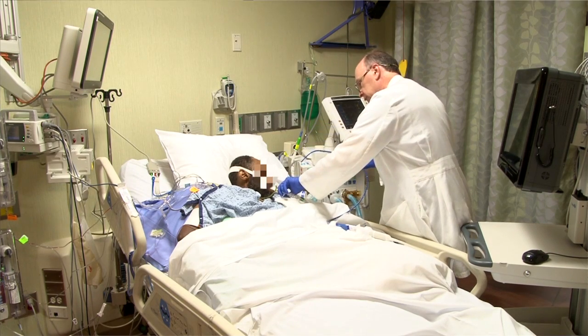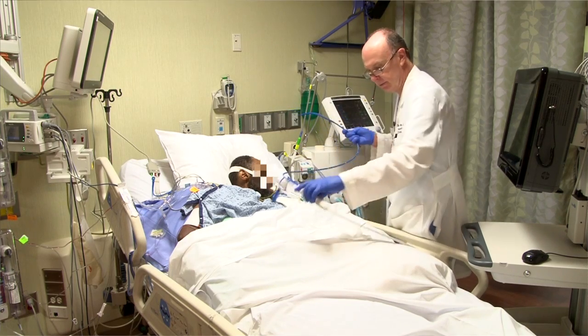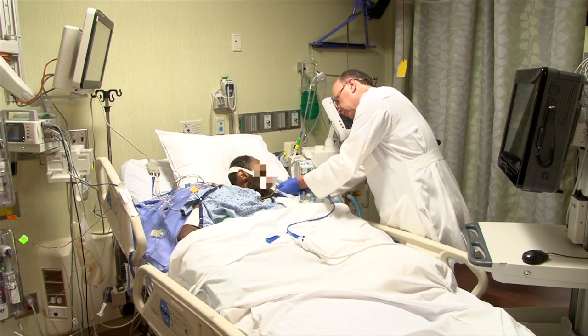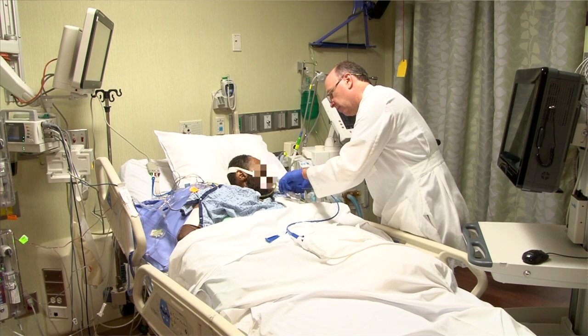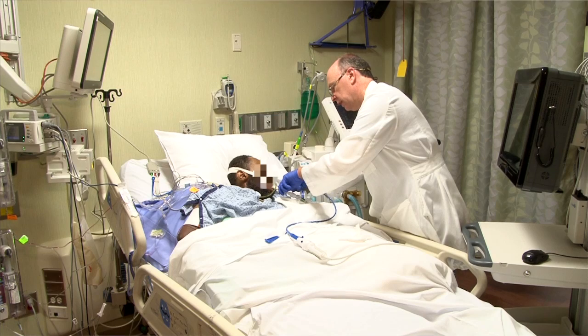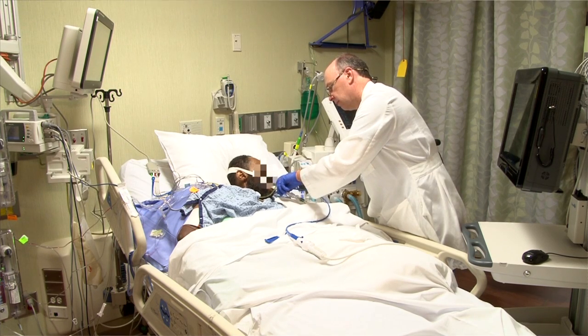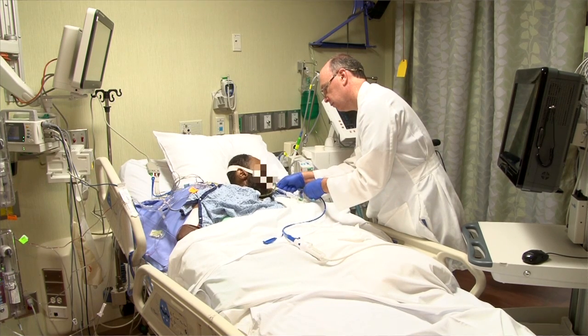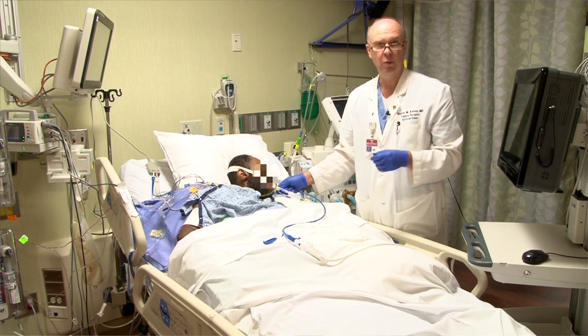I'm going to gently feel the patient's tongue here to help me get a line, and then just slide the probe over the top of the tongue until I get it into the back of the oral pharynx. Once I get it there, this patient's not paralyzed so I can feel him try to swallow, and I sort of gently wait until I feel him swallow and then try to gently advance that on into the esophagus. And there you go — you can feel it give and now we're ready to start our exam.